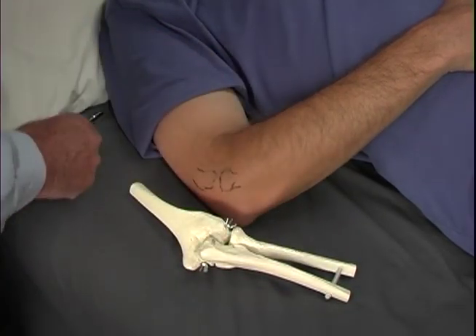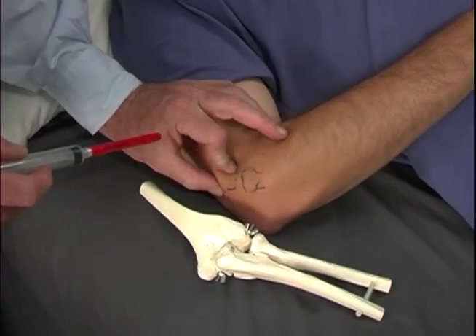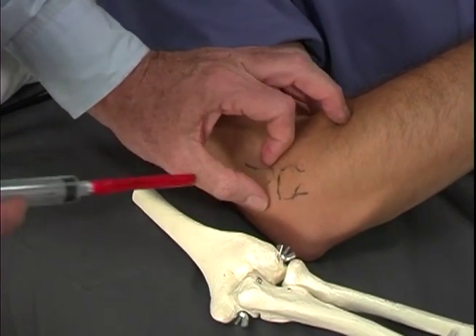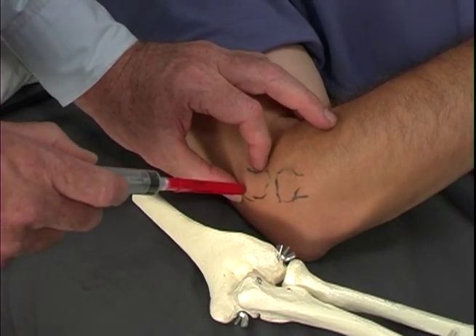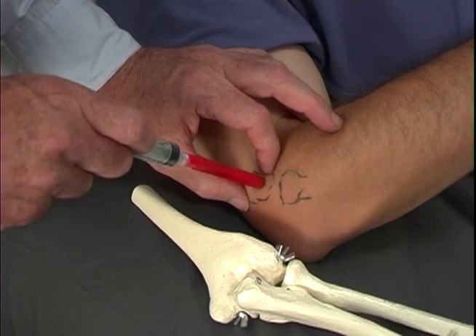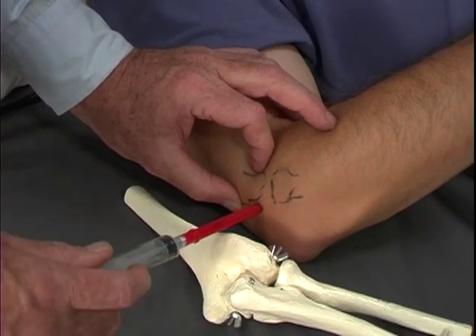Our injections are carried out by, again, carefully palpating the lateral epicondyle, and actually doing tiny, tiny injections, but thoroughly peppering that lateral epicondyle.